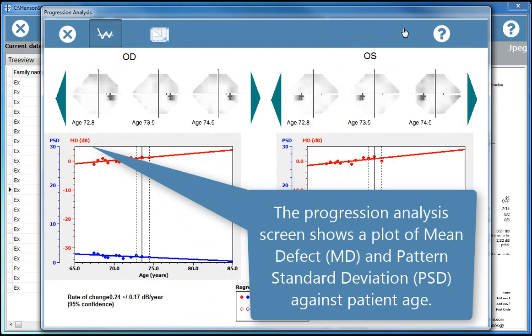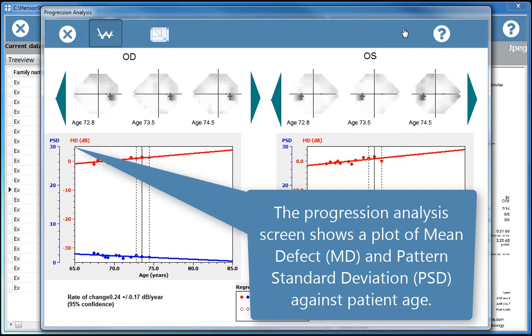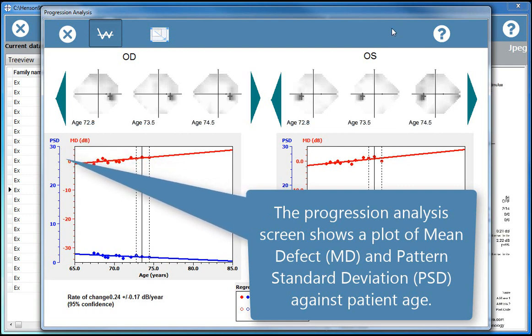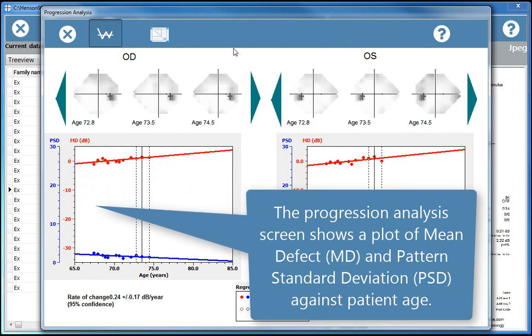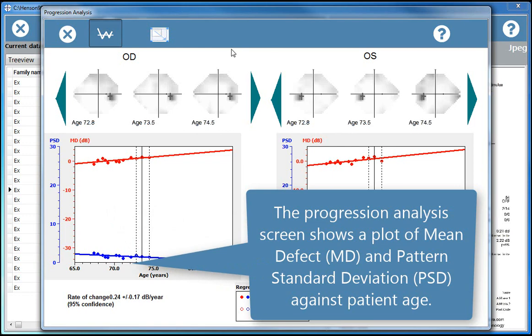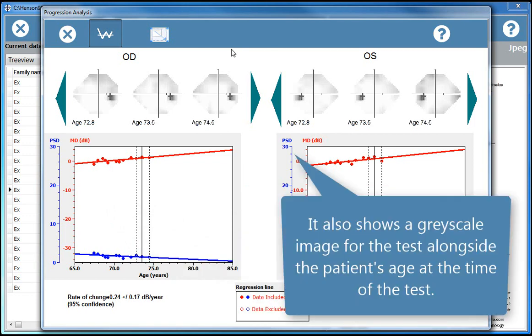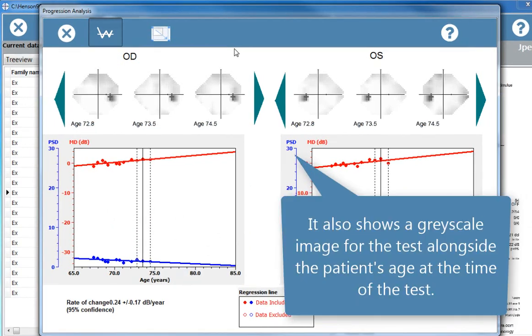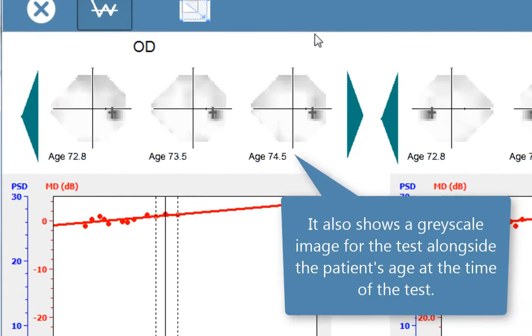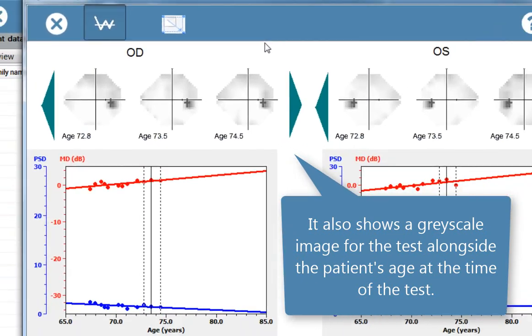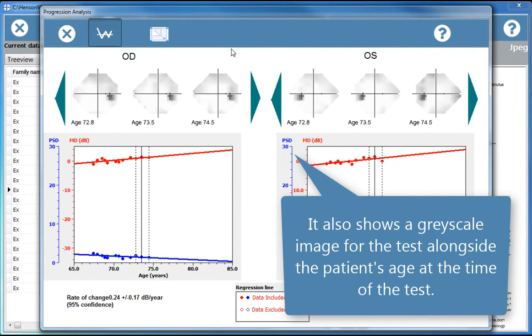The progression analysis screen shows a plot of mean defect and pattern standard deviation against patient age. It also shows a grayscale image for the test, alongside the patient's age at the time of the test.